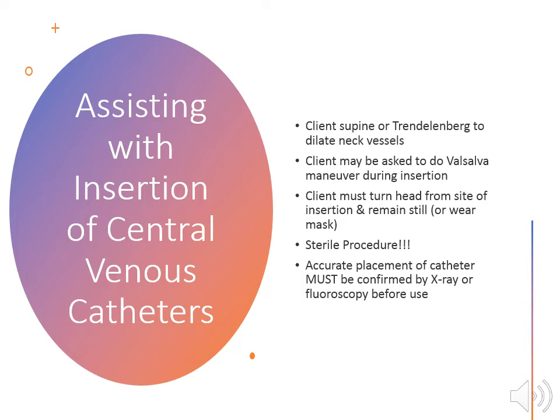Accurate placement of the catheter must be confirmed by X-ray or fluoroscopy before use. So no IV fluids, meds, anything can be instilled until placement is confirmed. And it may be required to obtain an X-ray for placement if the client arrives from another facility with the central line in place.